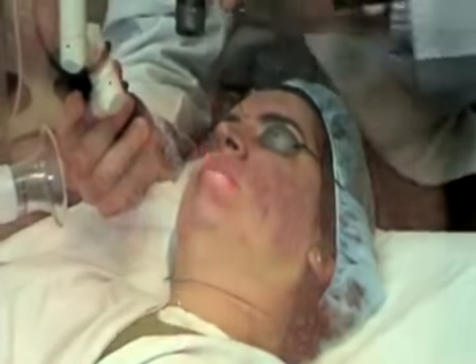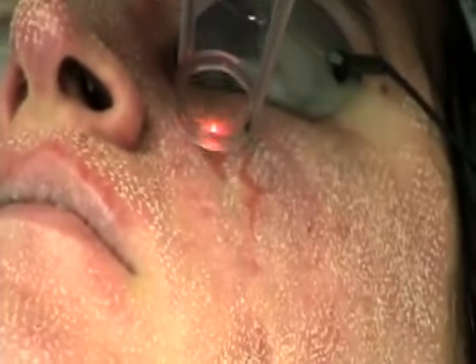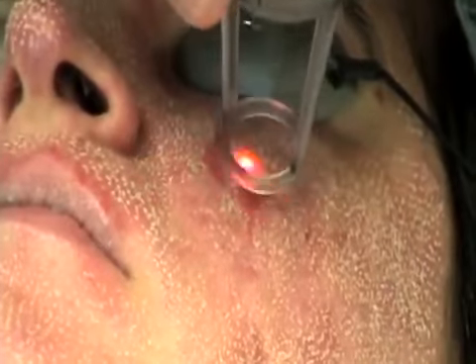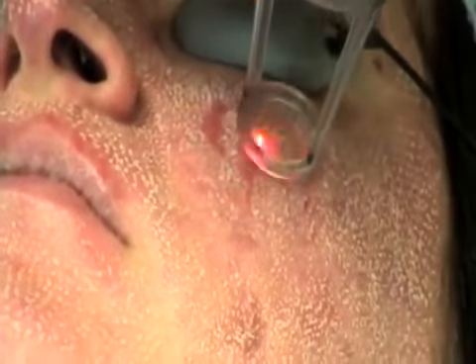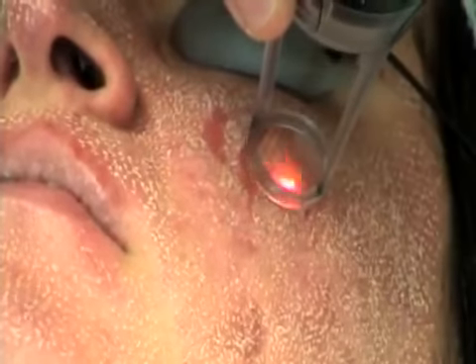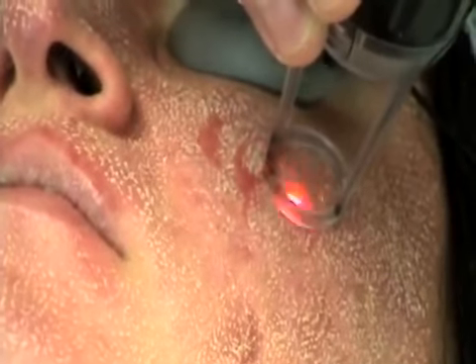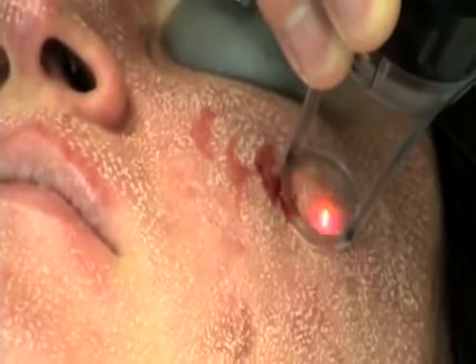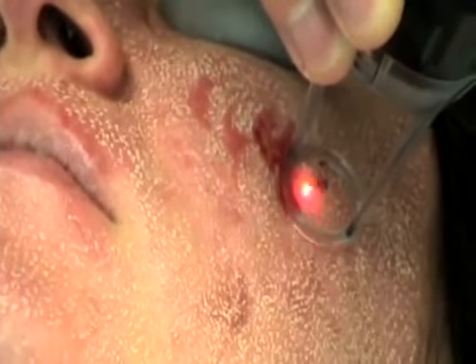When treating with the Deep FX, again, non-overlapping pulses are applied to the treatment area. Since the Deep FX penetrates much more deeply, small vessels may be hit and pinpoint bleeding may occur during the treatment. Here, only the central portion of the cheek where the deepest scars are is being treated with the Deep FX.